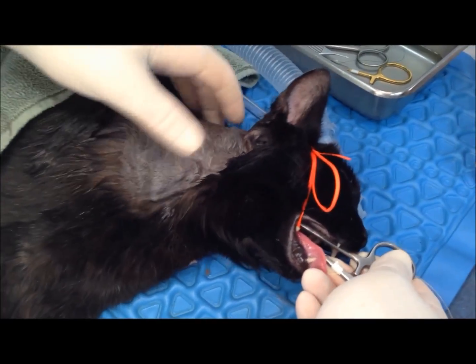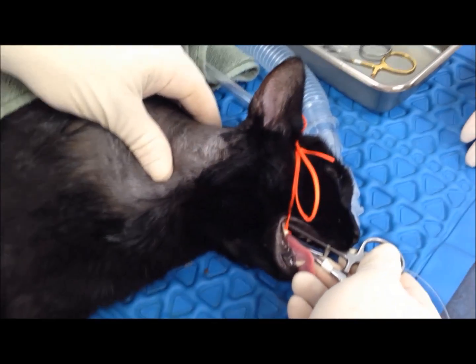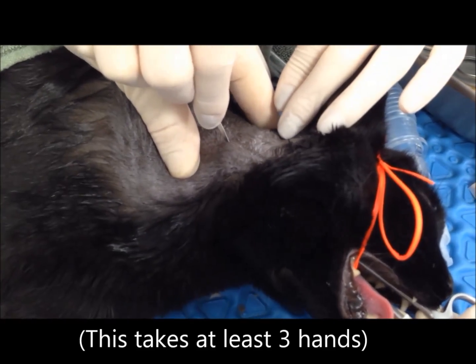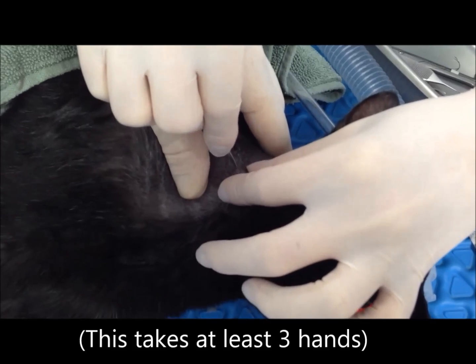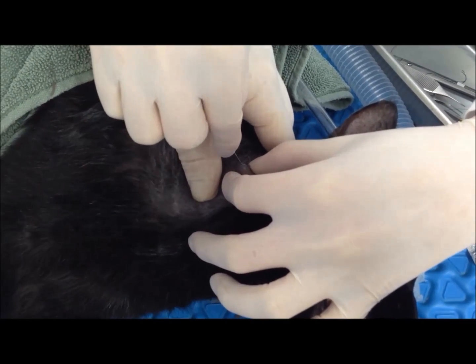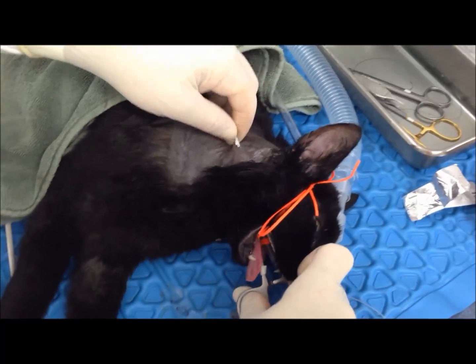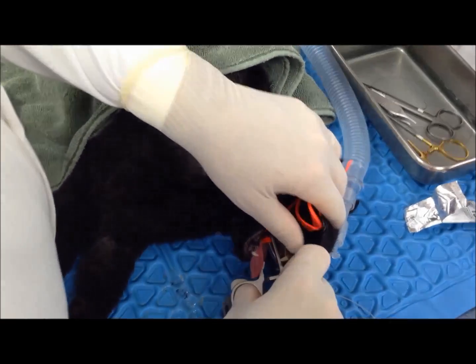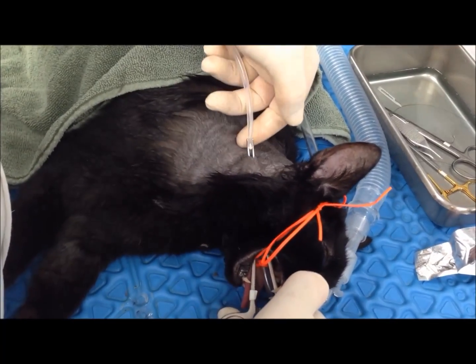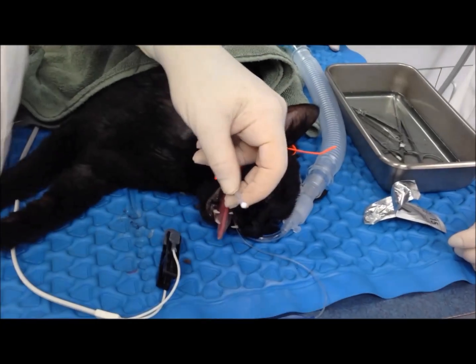We want to make sure that they hit this. Pull up everything. There's the wing of the atlas. You don't want to make your hole too big — you want that to come out like that. Then we'll go ahead and put it in and out, cut off the closed end aspect of it.